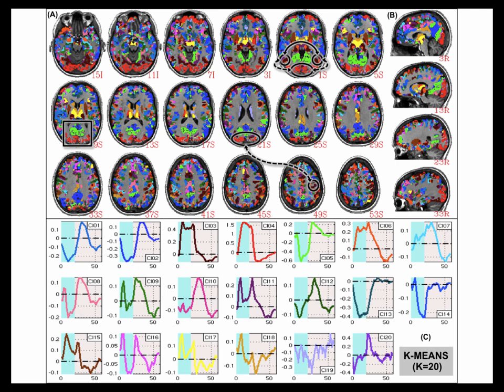So even if you look back at Logothetis' paper, 2001, where he was systematically varying contrast, this wasn't duration, but it was contrast versus magnitude, you get a nice relationship. But down to very, very low contrast, it becomes extremely nonlinear. So it seems that BOLD tends to amplify a little bit; any sort of low-level neuroactivity seems to trigger BOLD in a way that is nonlinear at very low contrast or very low durations.